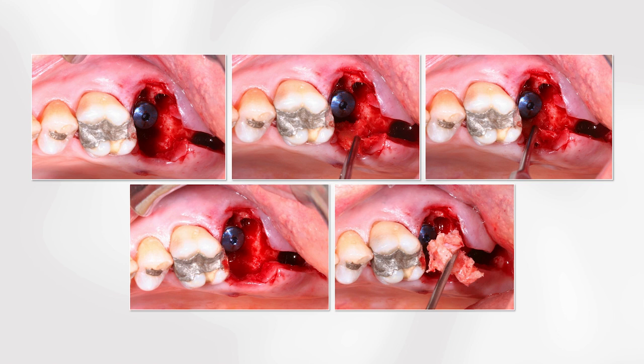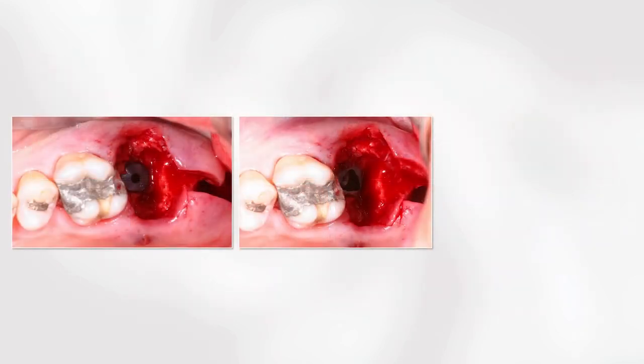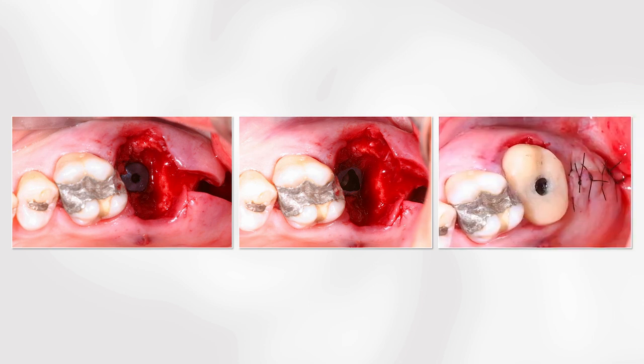First of all, we inserted a corticocancellous graft to restore the palatal wall. After that, the particulate bone was packed to completely fill the gaps, all the space around the body and especially the head of the implant. After this procedure was finished, the cover screw was removed and the provisional restoration was inserted.